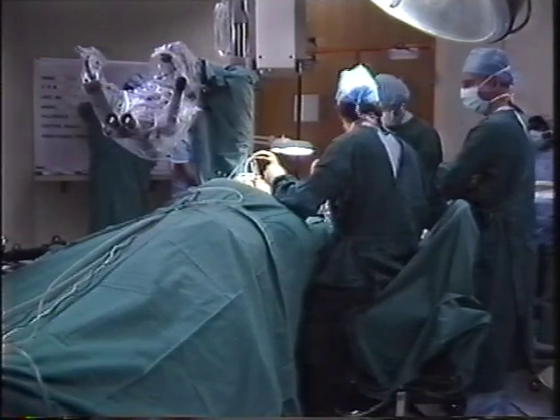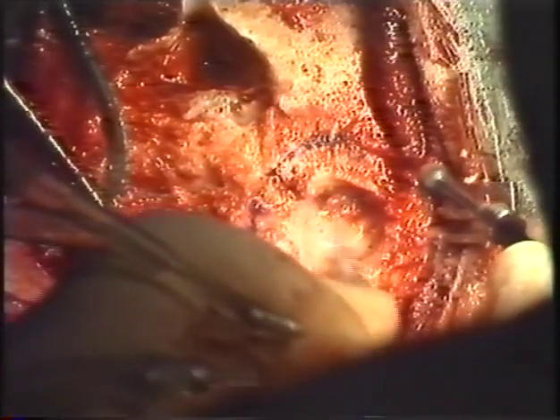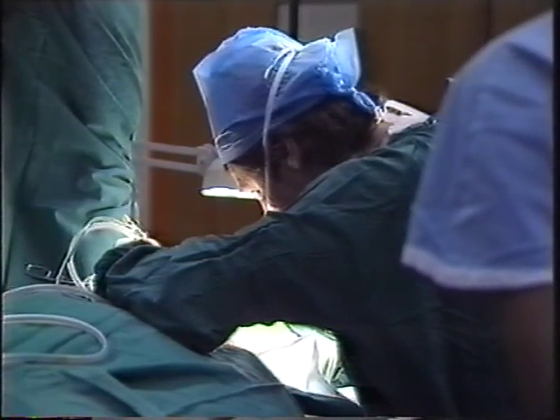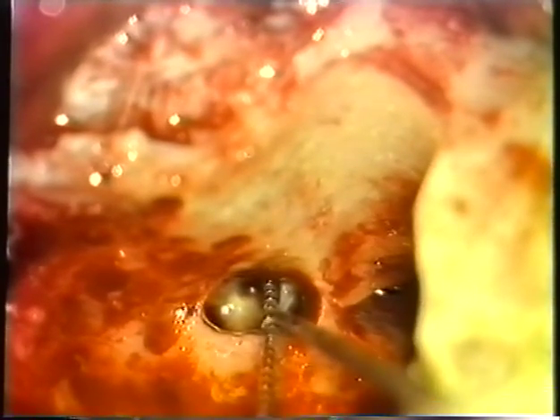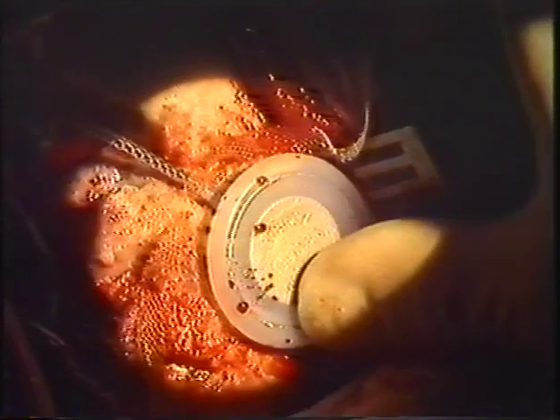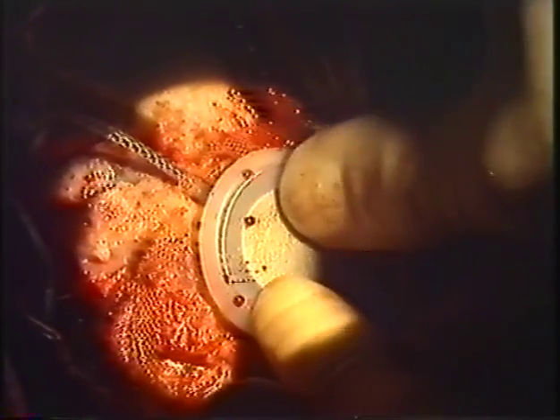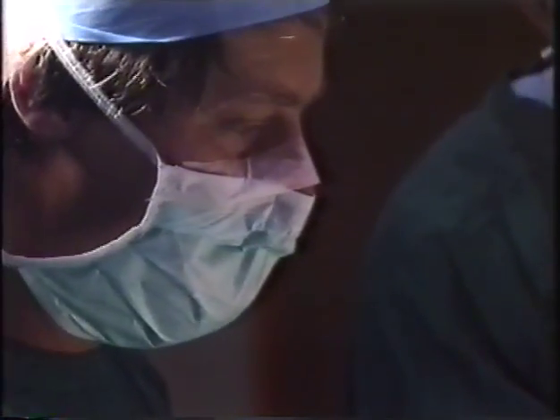Here you can see the round window being revealed. Next, the skull is prepared for the implant itself, and a circular hole is made to receive the body of the implant device. This is the implant, the 22-channel device, and here it is being inserted very carefully into the inner ear. Great care is taken so as not to damage the structures of the inner ear itself. Next, the body of the implant is firmly placed into the opening in the skull so that it is held solidly in position for all the patient's life. Ties around the tail of the implant prevent the lead from moving around.